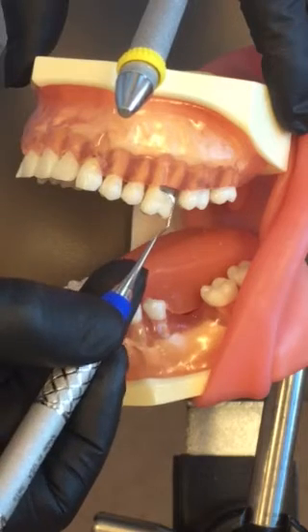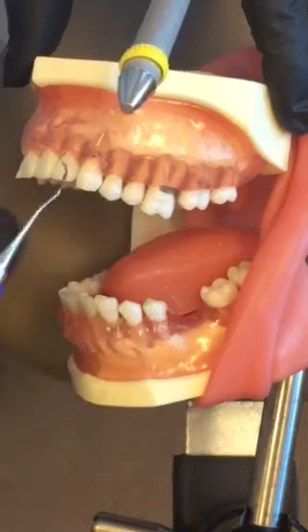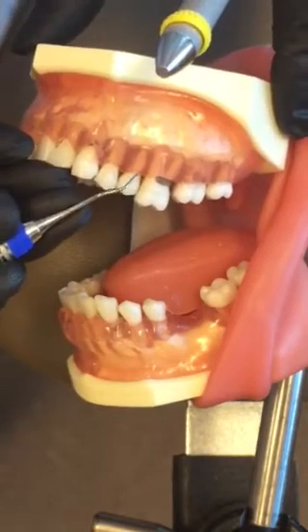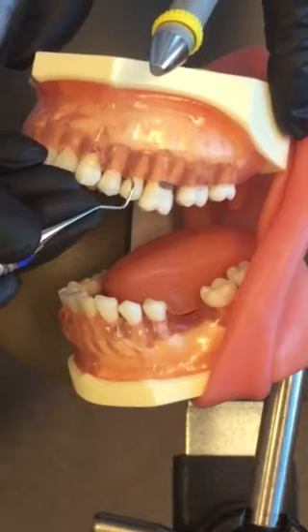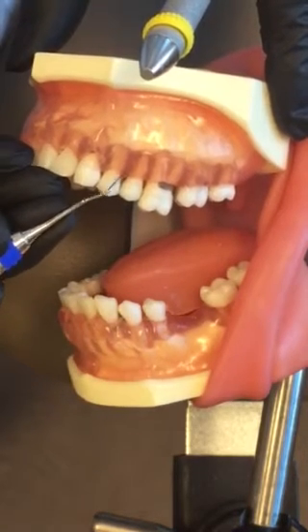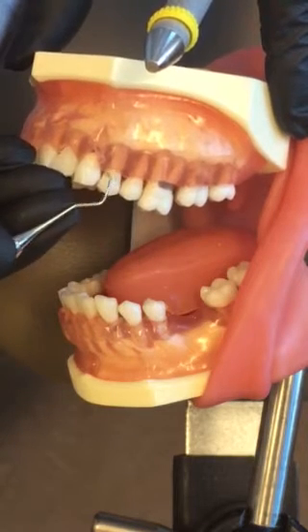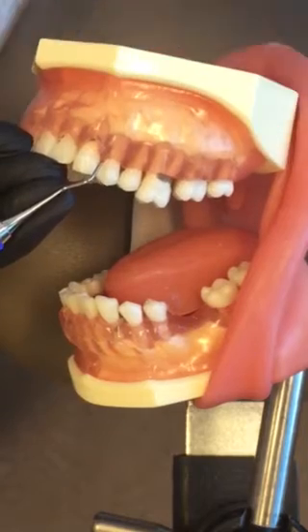On the buccal, go oblique around the mesial line angle. Same thing on your premolars: distal line angle, roll, begin distal line angle, and around. Notice now I've changed my fulcrum to the same arch and I'm fulcruming on the anterior teeth.